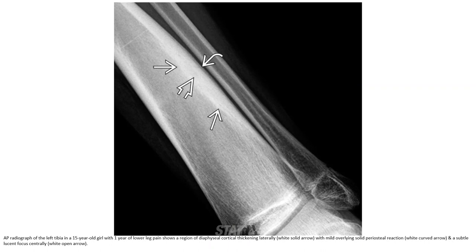Radiograph of the left tibia in a 15 year old girl with 1 year of lower left leg pain shows a region of fusiform cortical thickening laterally with mild overlying solid periosteal reaction and a subtle lucent nidus centrally.